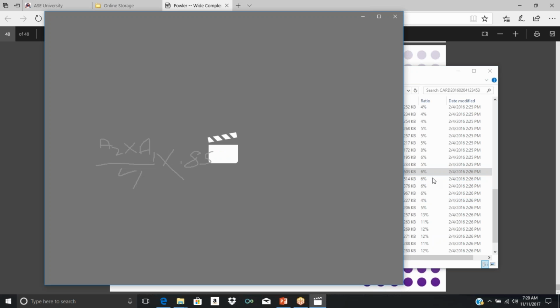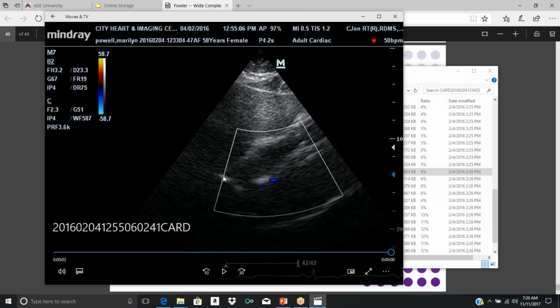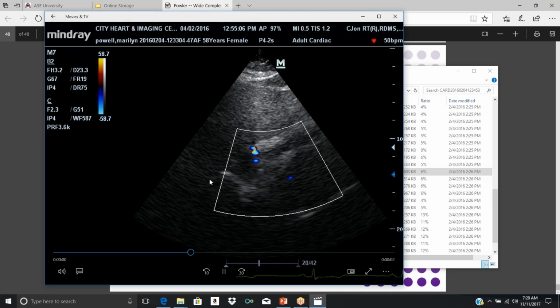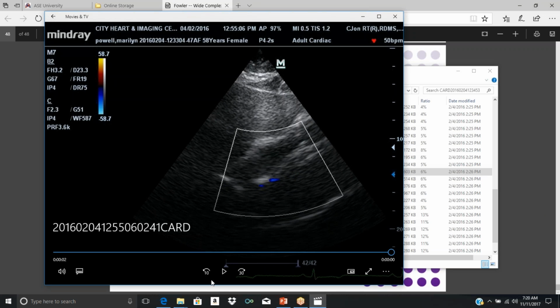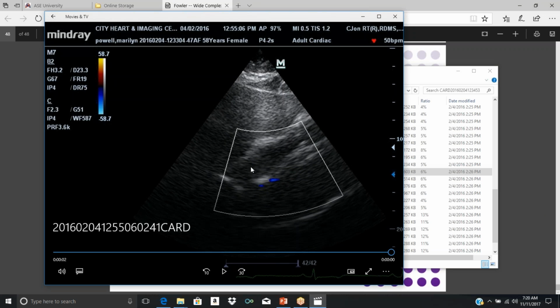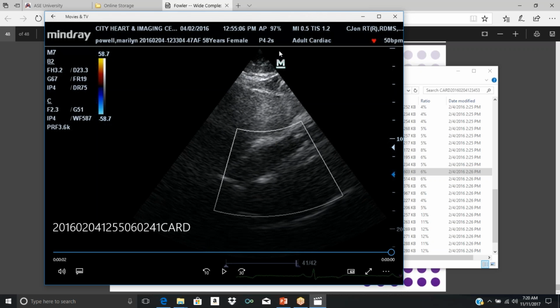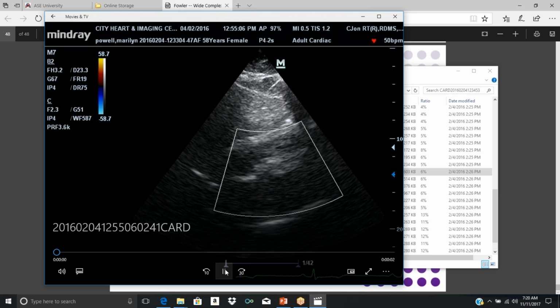So the current recommendation is to, all right, and this is your subcostal view. So the liver is over here, okay? The inferior vena cava is someplace right there, and you can see this blue color right there. Transducer is there. The blood is flowing into the right atrium. It's moving away from the transducer, and it's blue, or shades of blue.